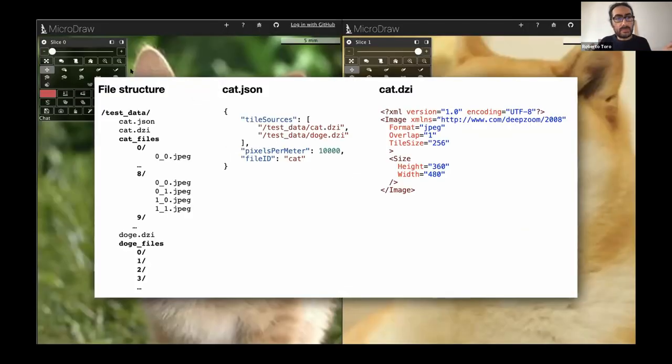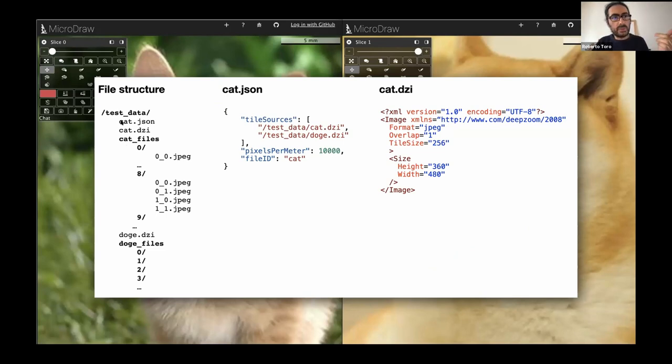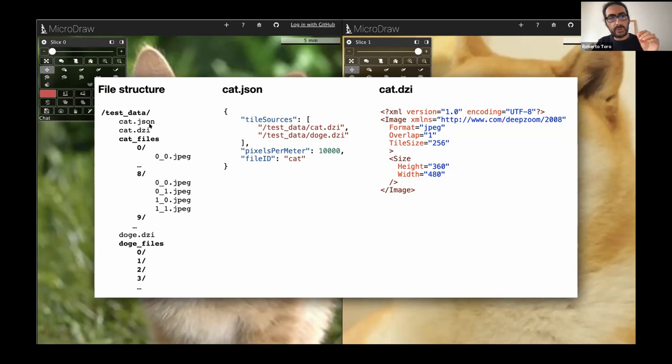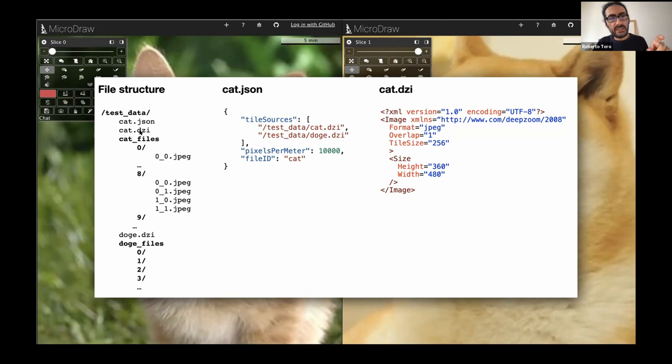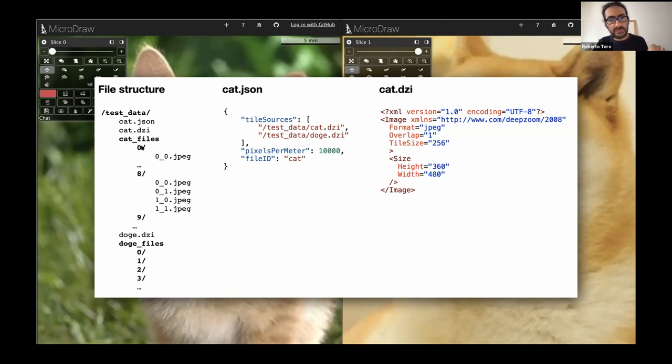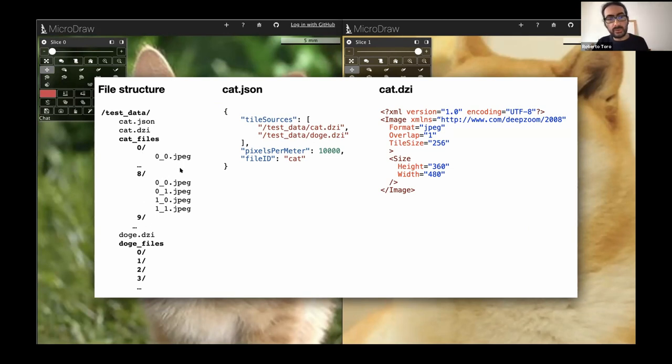If you have a file structure that would be this way, you need to create a cat.json file that will describe your data set. Then this cat.json in particular has two slices, the cat and the dog. Then there's a DZI, deep zoom image file for the cat with all the files. And here are the levels from zero to nine in this case. And then inside the JPEGs, which make all the small tiles and the same for the dog.